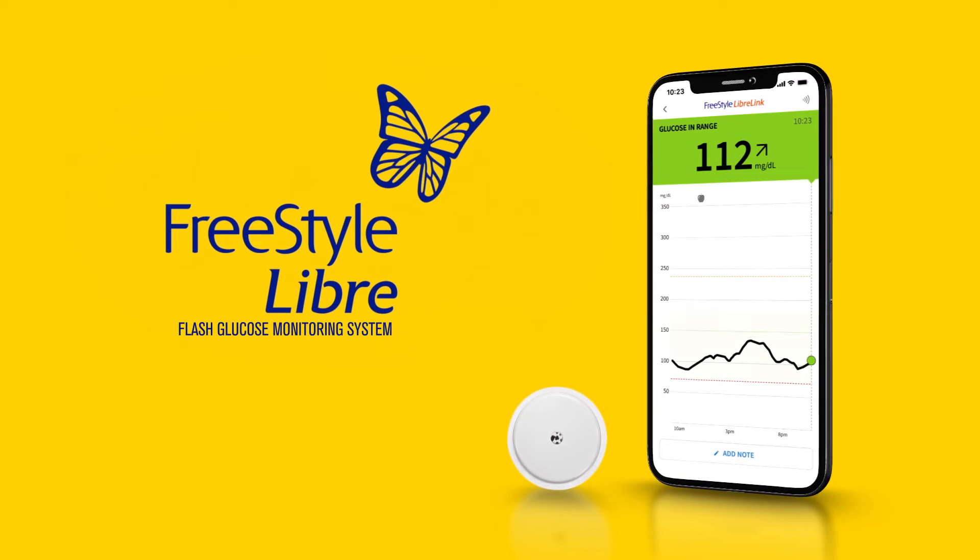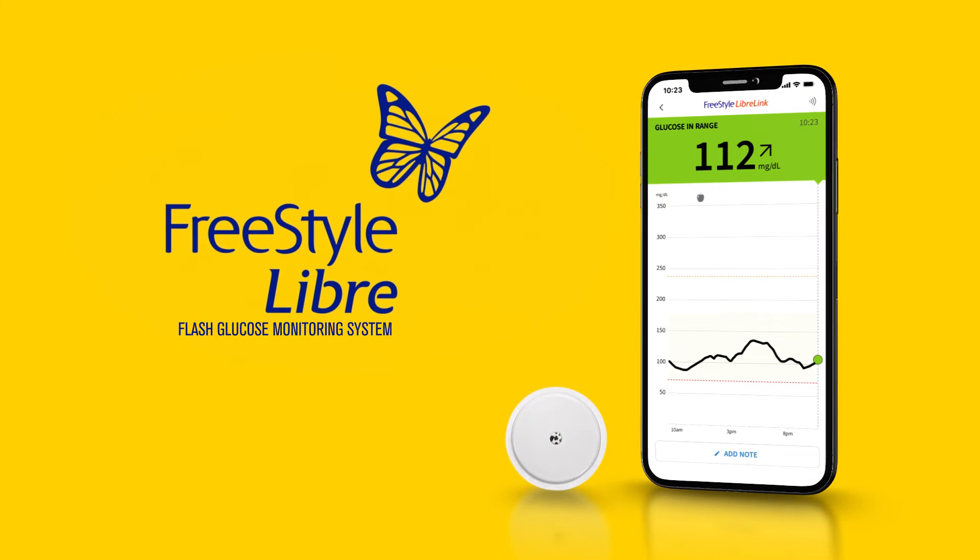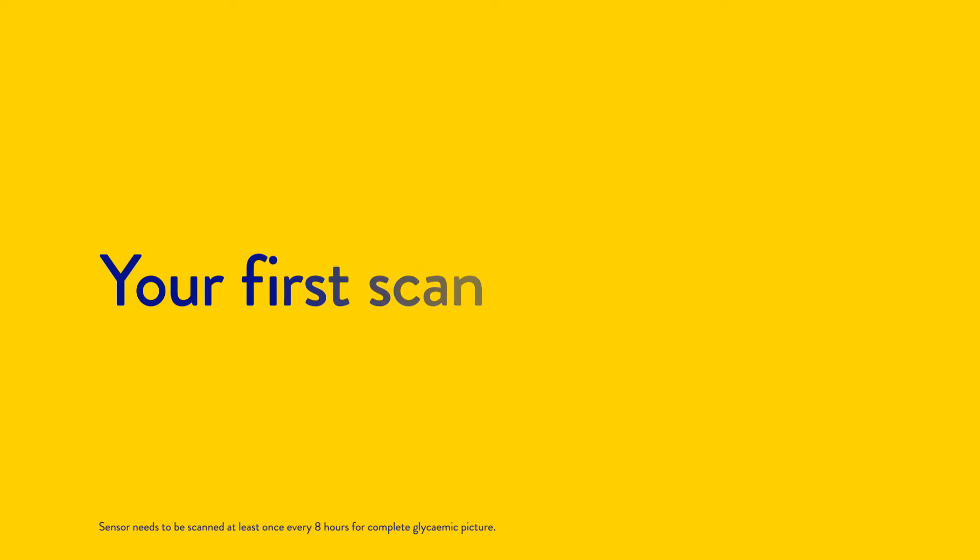The Freestyle Libre system is a sensor-based glucose monitoring system used worldwide that helps you monitor your glucose levels. In this video, we are going to talk about your first scan.